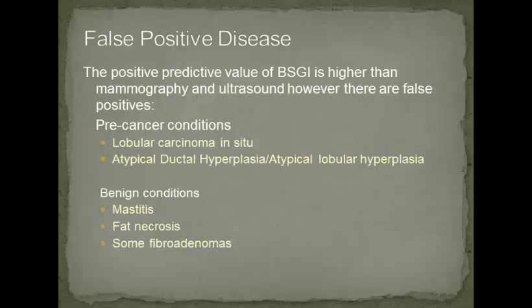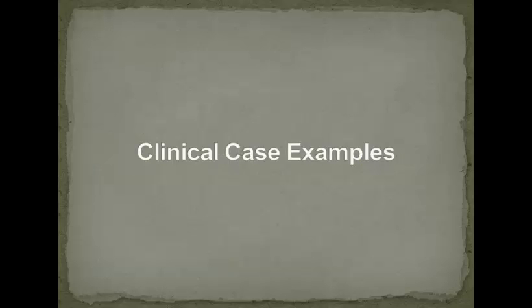But the fibroadenoma diagnosis, remember, is a very broad descriptor for this fairly complex group of tumors that can be very, very high cellular density or very fibrous, and so only some of those are positive on the technique. And then at times sclerosing adenosis as well.